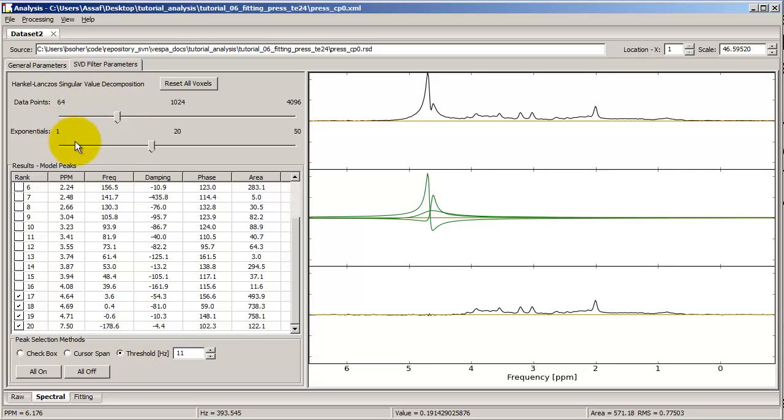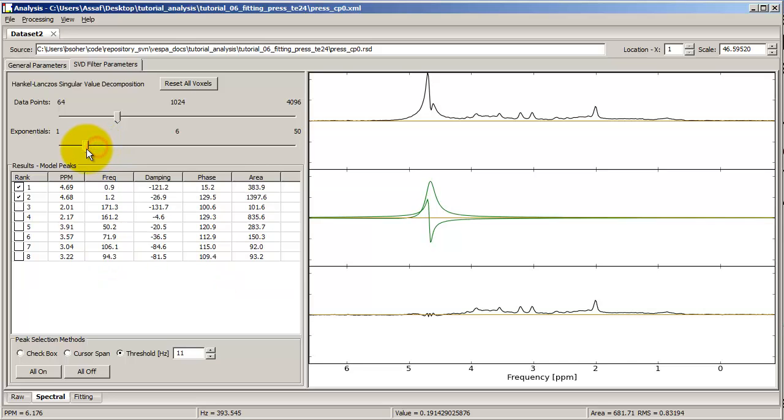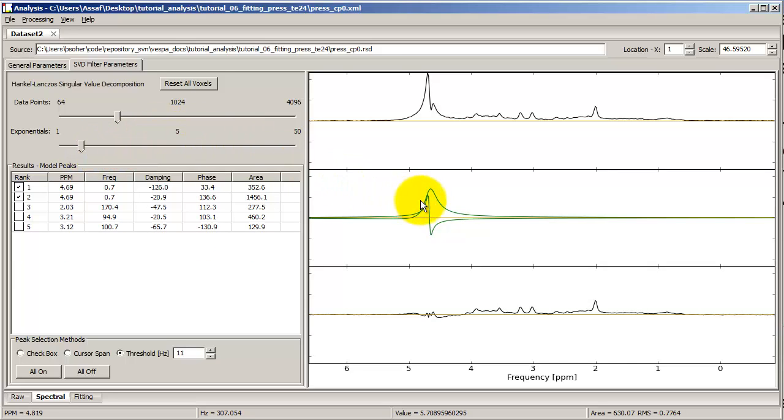And just a few words about exponentials and data points. First of all, make sure that the number of exponentials that you use is on the order of the number of peaks you'd expect in a typical spectrum. So 20 is a good number to start with. You can see what happens when you reduce it. And this algorithm works in real time, so it's fast. And it's nice because you can play around with the parameters fairly easily. So you can see that even if I reduce the number of exponentials quite substantially, I still get pretty good water suppression. Now I'm at 5 exponentials, and it's trying to model the water as 2 Lorentzians, and it's really doing not too bad of a job. So 20 is definitely a good starting point.